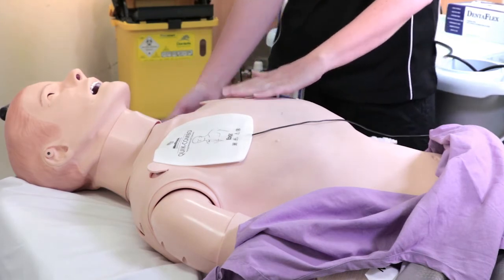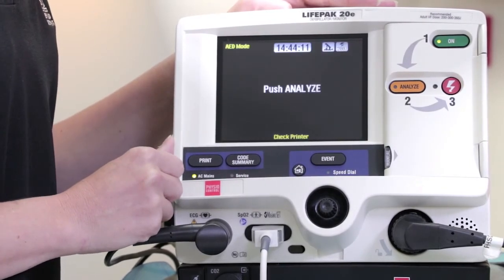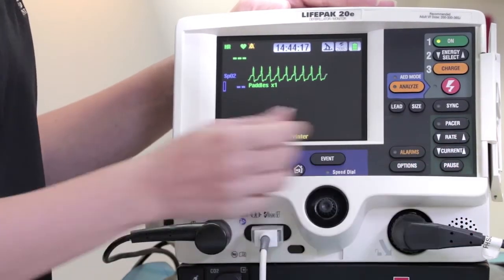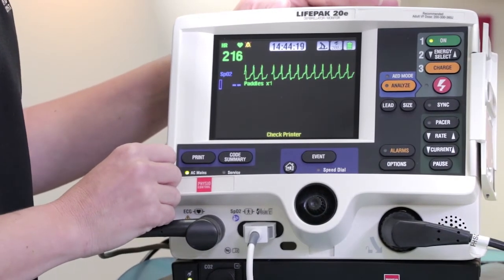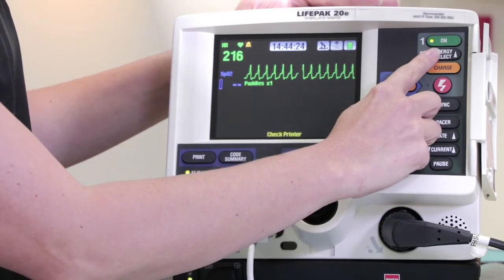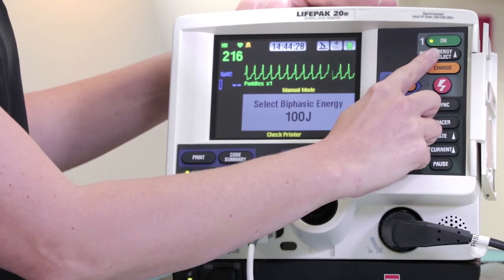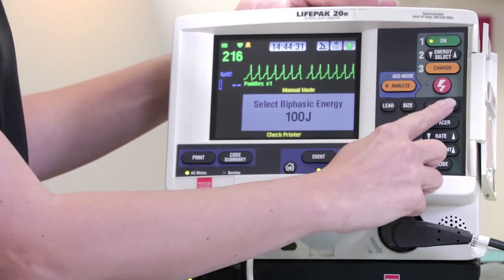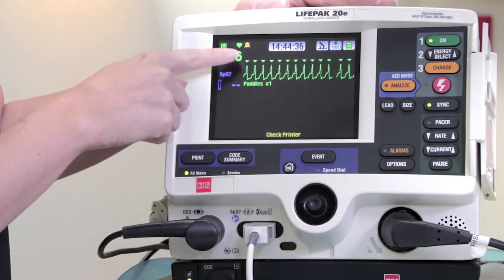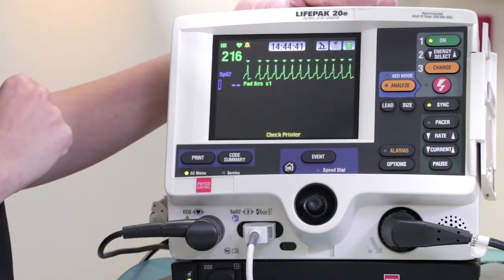Turn the defibrillator on, open the door into manual mode, and analyse the patient's rhythm. Once we have confirmed the need to cardiovert, set the joules using the energy select button — it is recommended that first-attempt cardioversion is set at 50 to 100 joules. As the defibrillator automatically defaults to 200, we will be dialing down. Then press the sync button — this will display inverted triangles on your screen which will indicate your R wave, preventing us from delivering the shock on the T wave, which can cause VF.